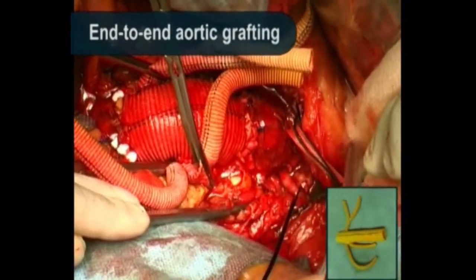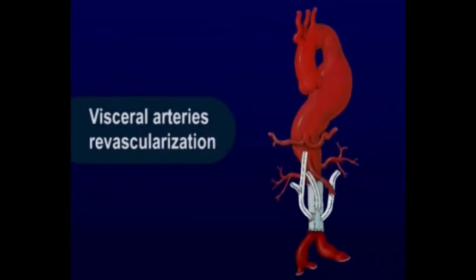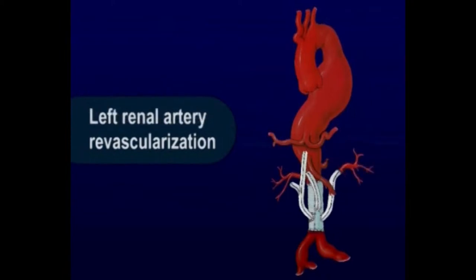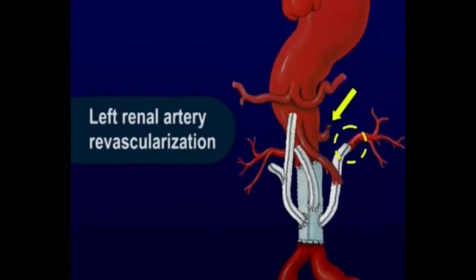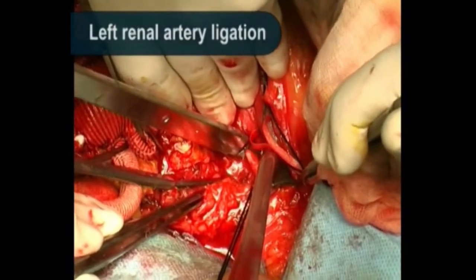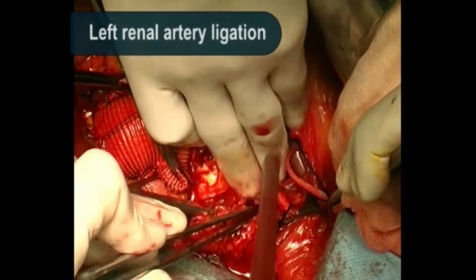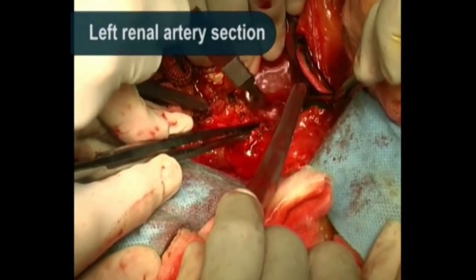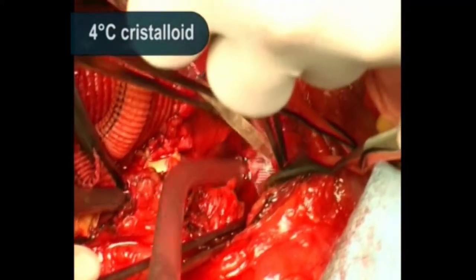Following aortic revascularization, visceral vessel rerouting is started, usually from the most difficult vessel to access. In this case, the left renal artery is clipped at the origin and the kidney perfused with a rapid infusion of cold crystalloid solution. An end-to-end anastomosis is then performed and the kidney re-perfused.